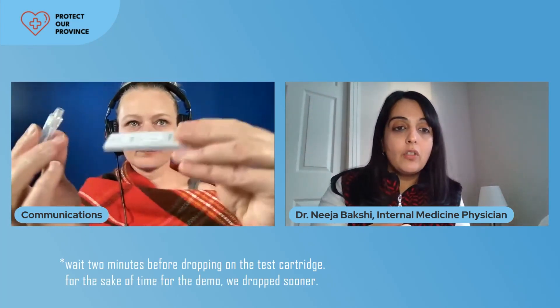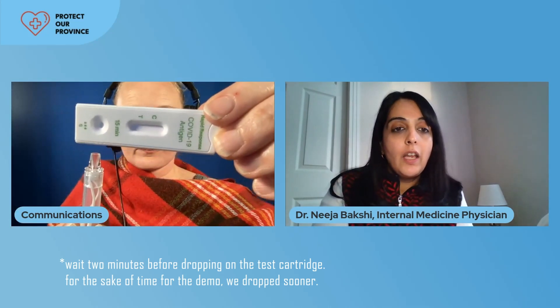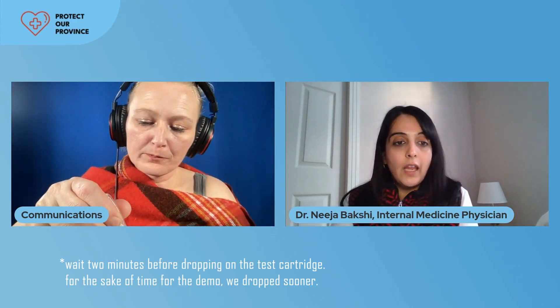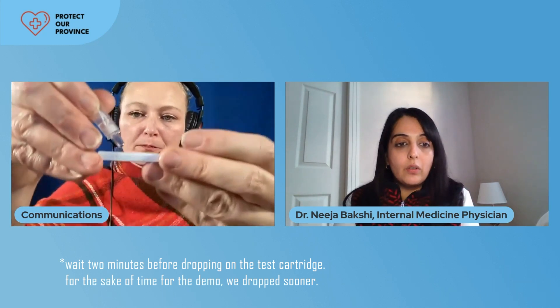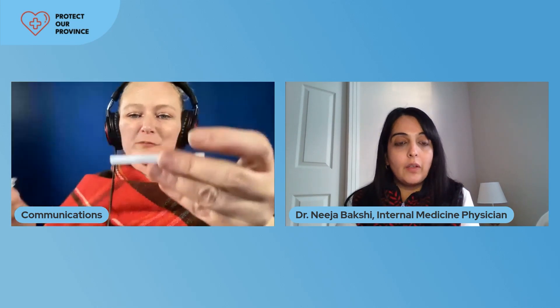Now we're going to take our test. You see the little circle at the bottom — we're going to put in three to five drops there. Make sure that you don't get it anywhere else. One, two, three, four, five. You want to make sure that you lay it flat — you don't want to hold it up vertically at this point. After about 20 to 30 seconds you should see that control line show up. What you may notice is the fluid goes across the test and may show a different color to the test, but it will clear up.